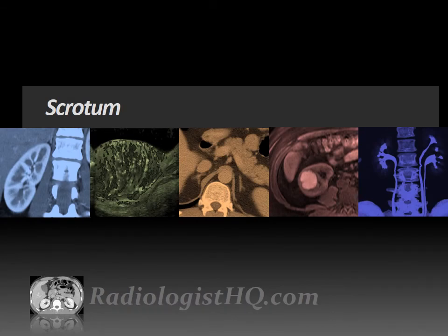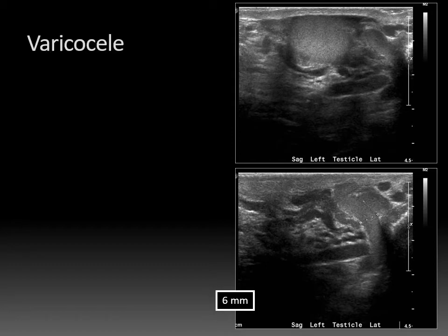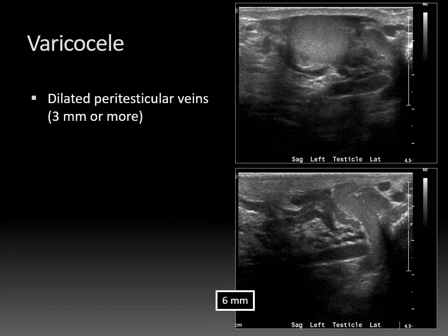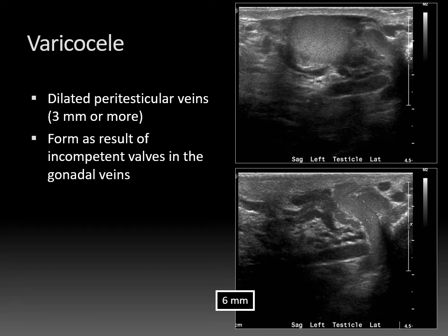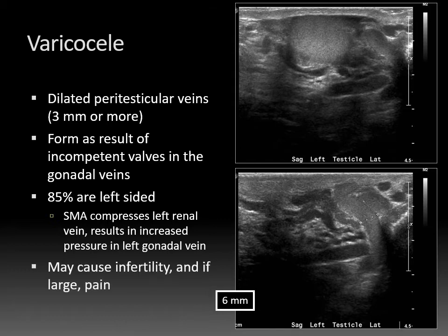Now for the final section: the scrotum. On ultrasound, here is the normal testis, but there is also a dilated tubular structure measuring about 6 millimeters — classic for a varicocele. A peritesticular vein measuring 3 millimeters or more is consistent with a varicocele. They form as a result of incompetent valves in the gonadal — testicular — veins. Most are left-sided, 85%, because the testicular vein drains into the left renal vein at a 90-degree angle, and the SMA compresses that left renal vein, causing increased back pressure into the gonadal vein. Large varicoceles can cause infertility and pain.